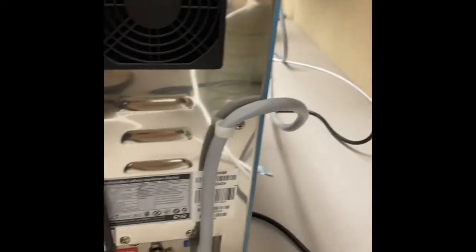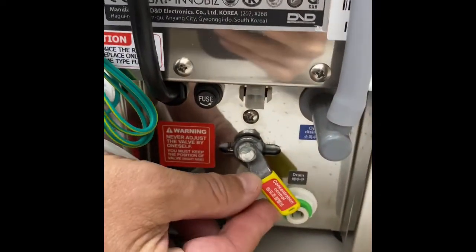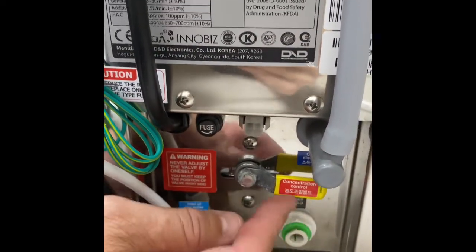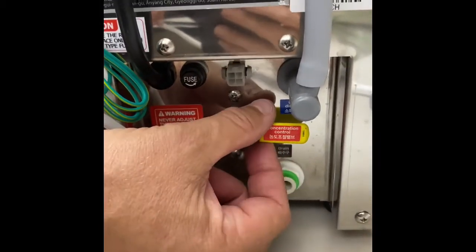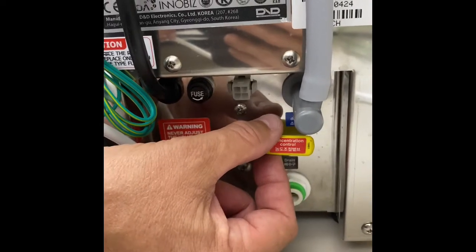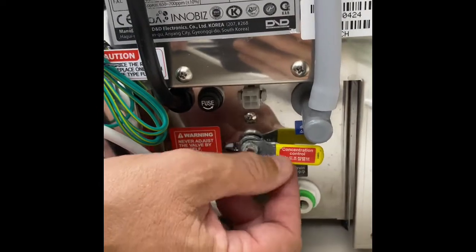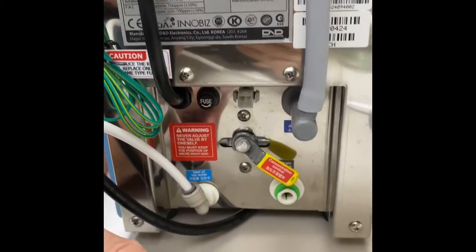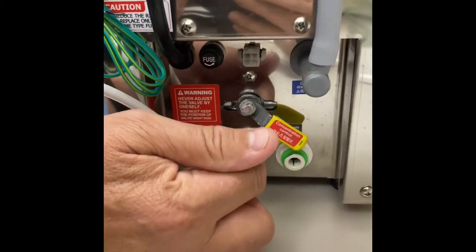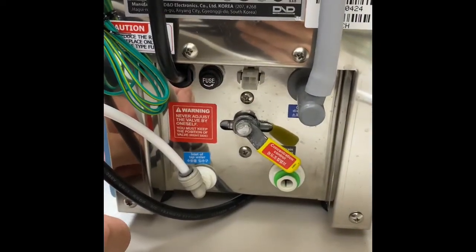On the back of the machine there's an adjustment valve. When it's in the lower position, you're going to create a higher PPM solution. This valve is adjustable — you can move it up to the 3 o'clock position, which gives you a lower PPM. When you lower it back down, you're reducing the flow of water into the machine, and you can get up to about 500 PPM solution. It's also UL registered.